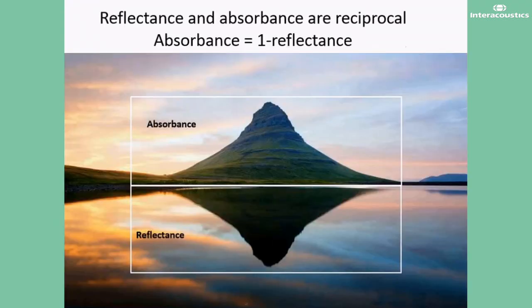Now, some of you may be confused about reflectance and absorbance. Reflectance and absorbance are reciprocal measures. Earlier studies have mainly reported in terms of wideband reflectance. In 2013, there was a workshop of experts held, and they all came to a consensus that we need to start reporting the values in terms of absorbance. Because as audiologists, we are all quite familiar with the A-type tympanogram and a nice positive peak, so absorbance would be much easier to interpret. So from 2013 onwards, you'll see the articles reporting in terms of absorbance. As I said, they're reciprocal, and absorbance is 1 minus reflectance.